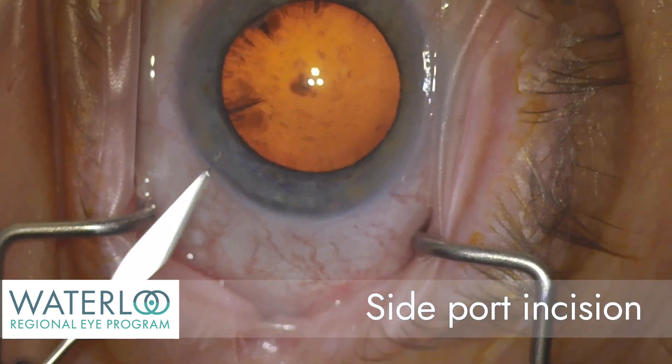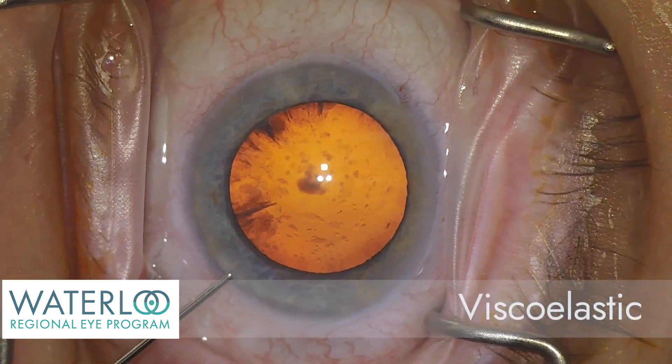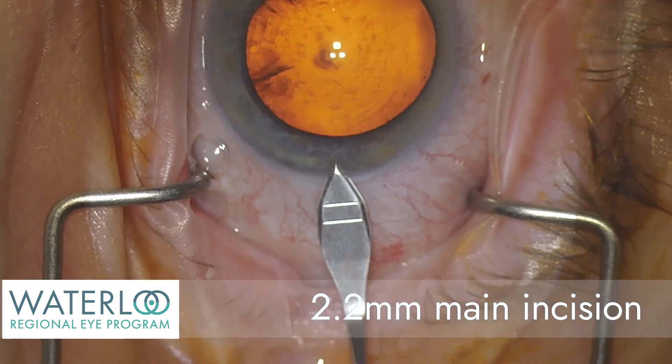A side port incision is created. Viscoelastic, a gel-like material, is used to maintain the eye pressure, and a self-sealing incision is made.